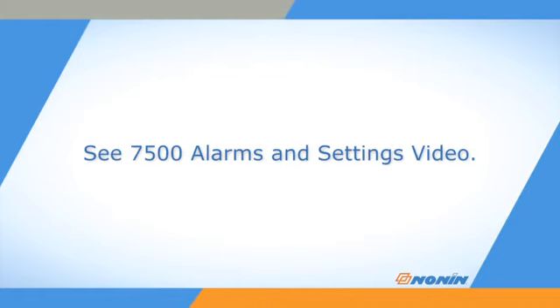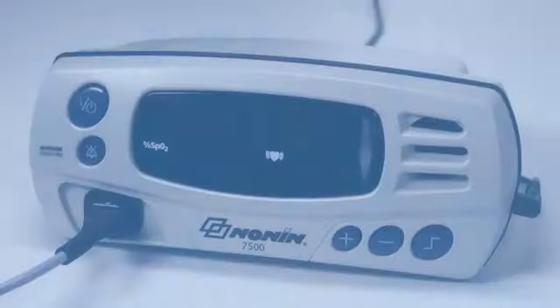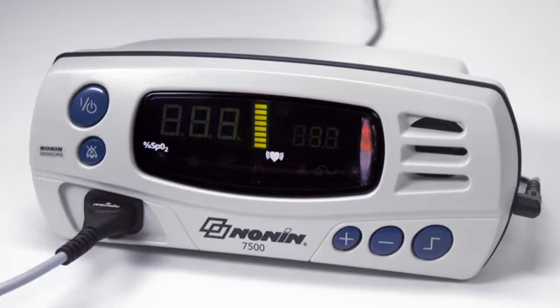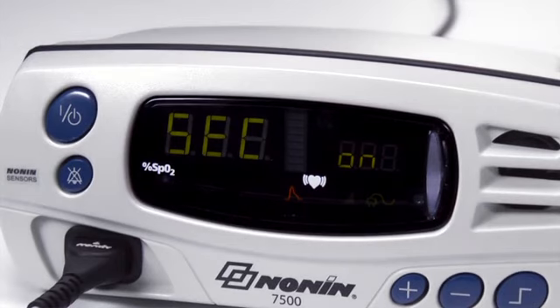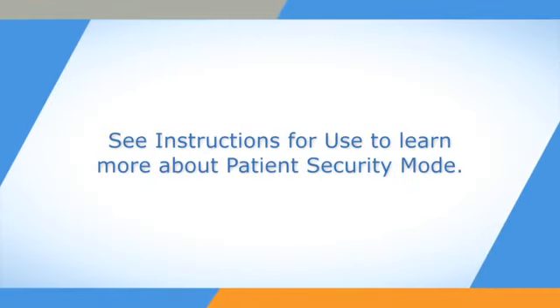A patient security mode may be set to prevent changes to alarm limits and a number of alarm and functional settings. When the model 7500 is turned on in patient security mode, SEC on is displayed in the display area, and 3 informational tones sound. The upper alarm limits are then displayed, followed by the lower alarm limits. Refer to the instructions for use to learn how to set or cancel patient security mode or reprogram settings.